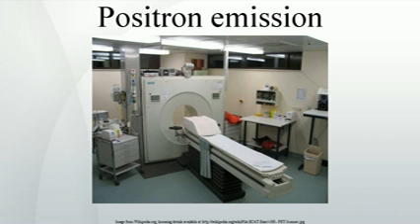A seizure focus will appear as hypometabolic during an interictal scan. Several radiotracers, that is radioligands, have been developed for PET that are ligands for specific neuroreceptor subtypes, such as raclopride and fallypride for dopamine D2/D3 receptors, MCN5652 and DASB for serotonin transporters, or enzyme substrates, for example 6-FDOPA for the AADC enzyme. These agents permit the visualization of neuroreceptor pools in the context of a plurality of neuropsychiatric and neurologic illnesses.